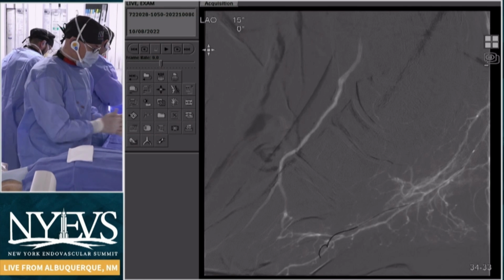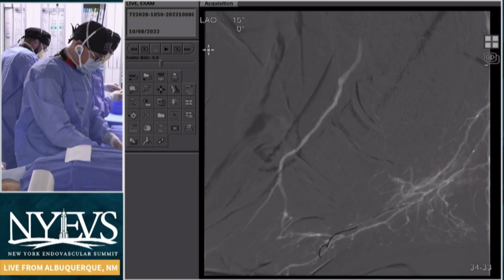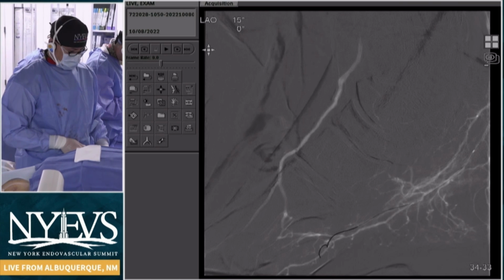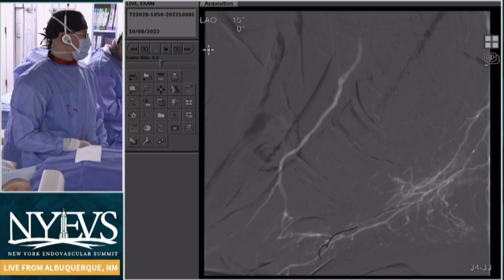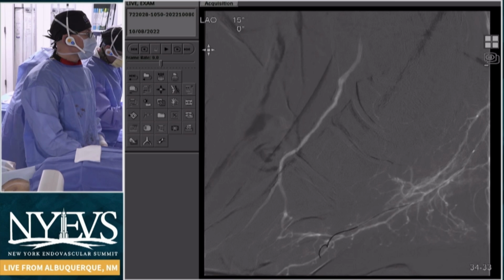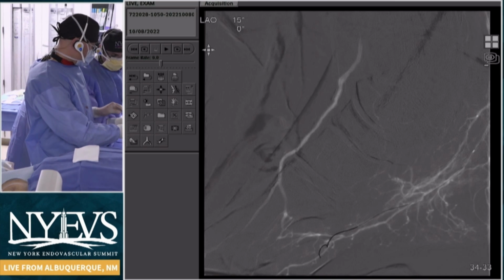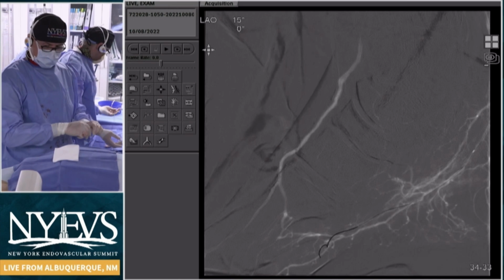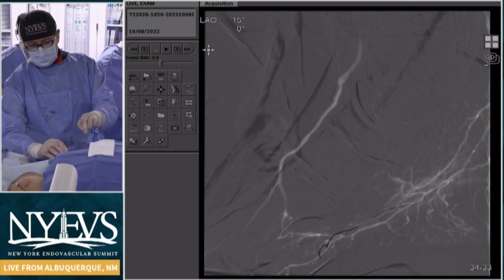So Sahil, you're a busy operator at Columbia. How often in your practice are you or your colleagues really intervening on the below ankle vasculature at this point? Yeah, I think it depends on the substrate. We frequently will, probably in about 5 to 10% of these patients. The challenge is that we try very hard to preserve options, and frequently these people come with WIfI classes that are, as we've included in these trials, relatively low.